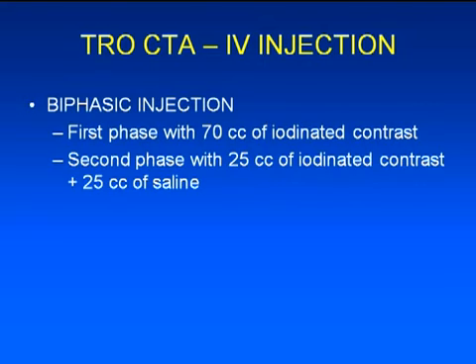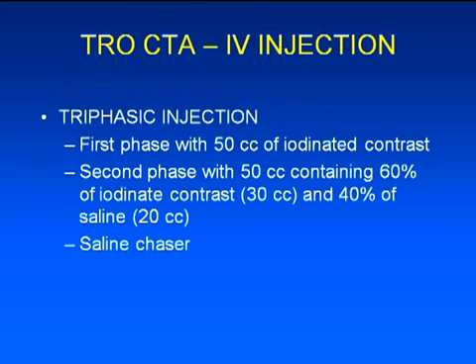There is also, in the literature, the triphasic injection. I don't see much difference from the biphasic, but it's undiluted contrast, diluted contrast, and I guess they do an extended saline chaser to really clean the SVC. You just have to be careful with that, because if you go too late, that pure saline is going to be in the pulmonary artery and you're going to get a non-diagnostic PE CT, so that's not going to be a triple rule-out either.